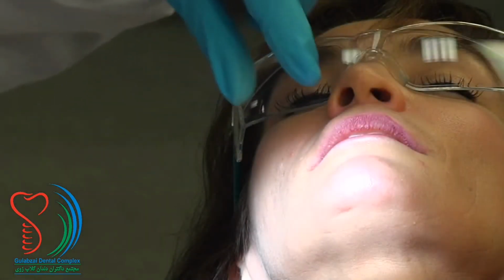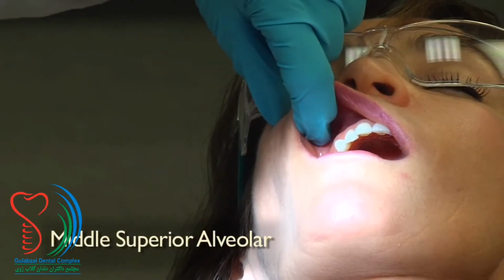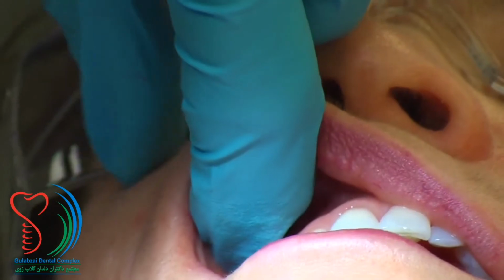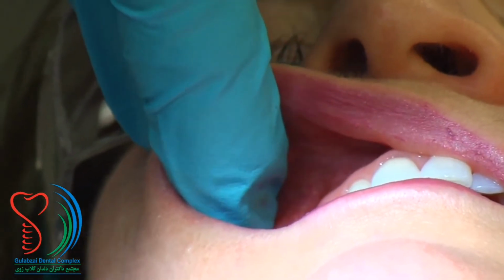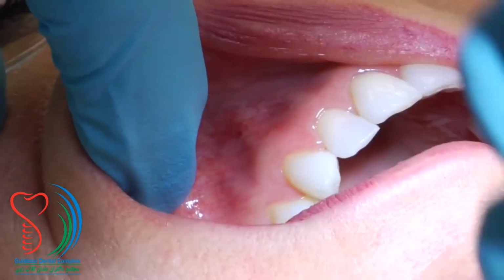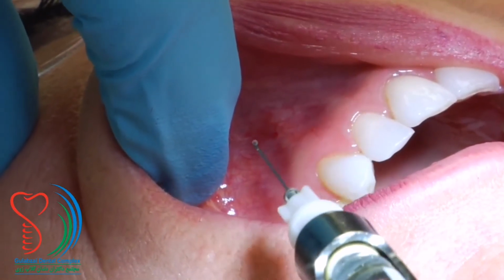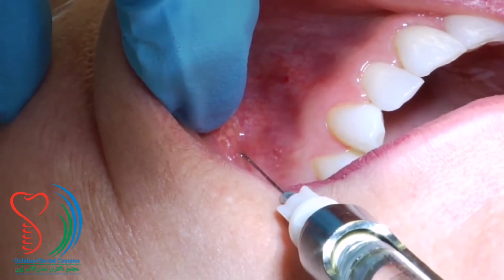The next injection we're going to demonstrate is the middle superior alveolar. To distract, the thumb of the non-dominant hand is resting slightly forward of the zygomatic arch. Again, with downward pressure for distraction, the lip is gently lifted and pinched slightly. The insertion site is over the second premolar in the vestibular area.